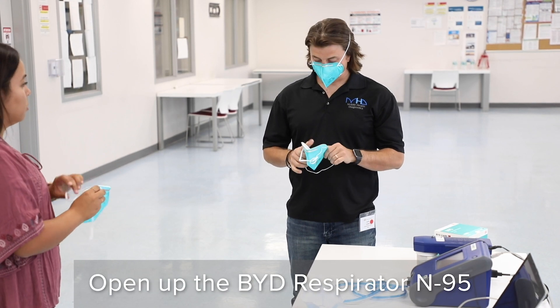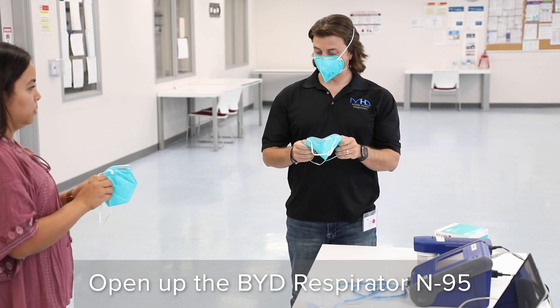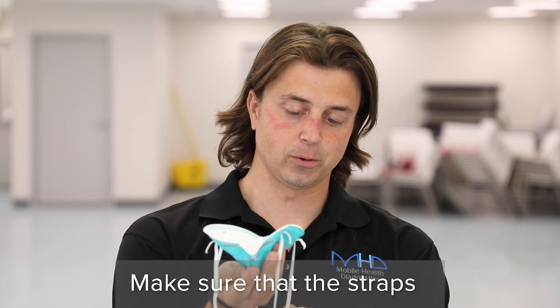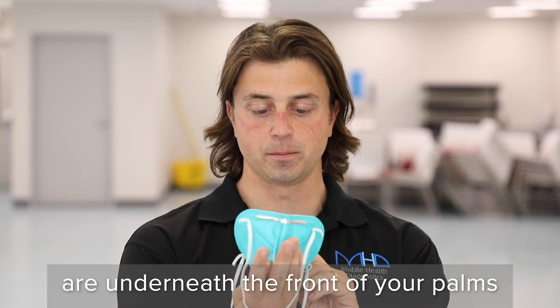The first thing you're going to do is open up the BYD respirator N95 and cup it into your hands. Make sure that the straps of the BYD respirator are underneath the front of your palm.